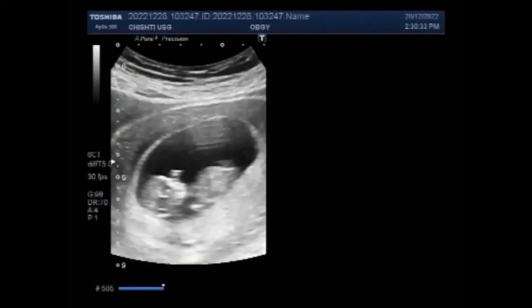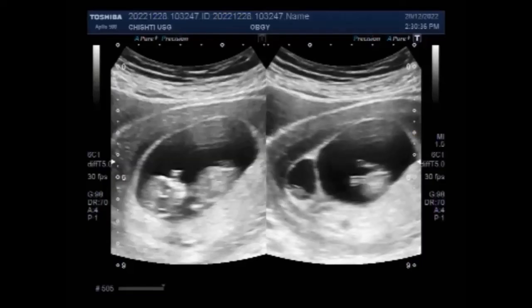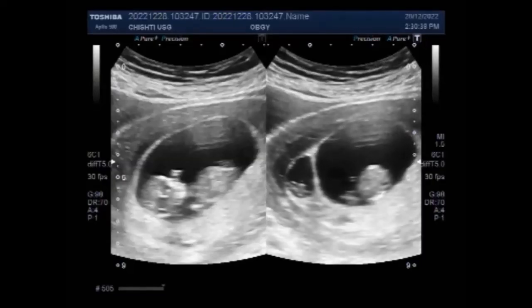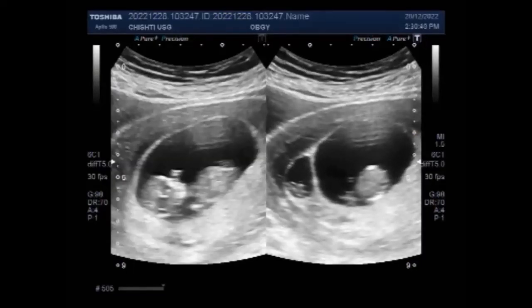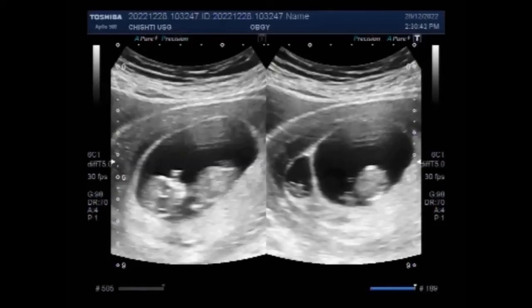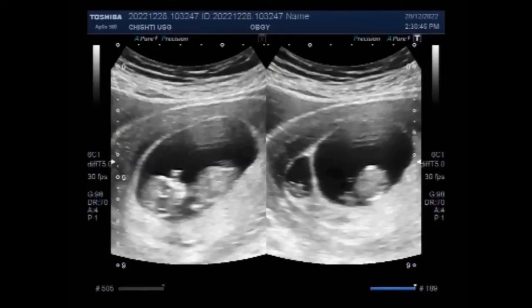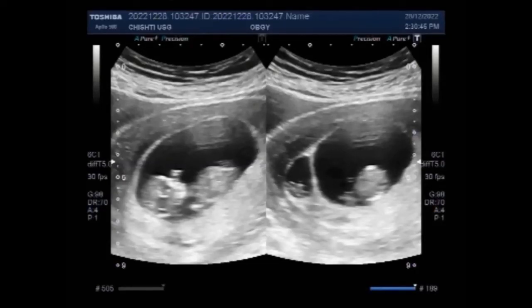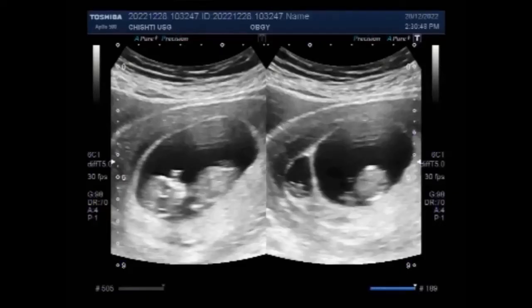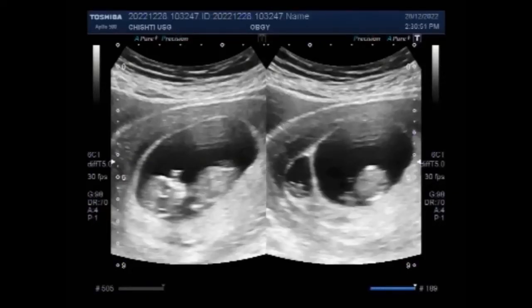This patient came with complaints of vaginal bleeding and spotting, and you can see there is Vanishing Twin Syndrome.